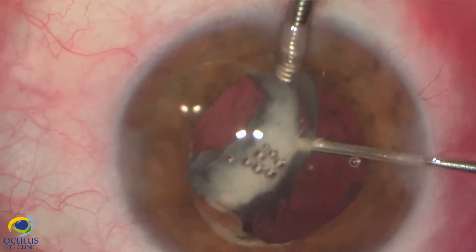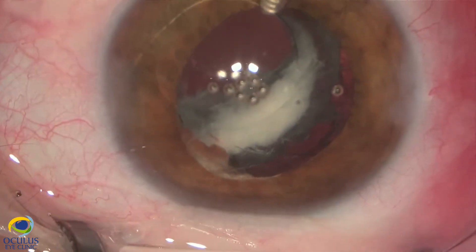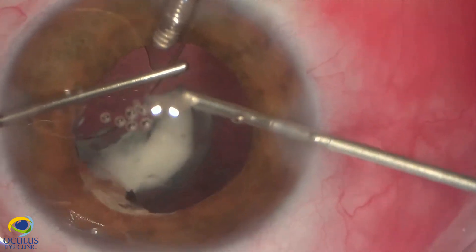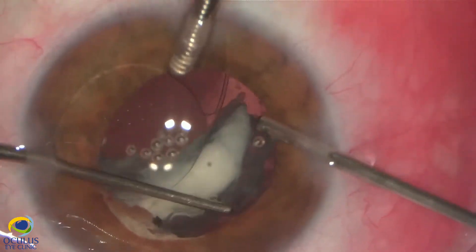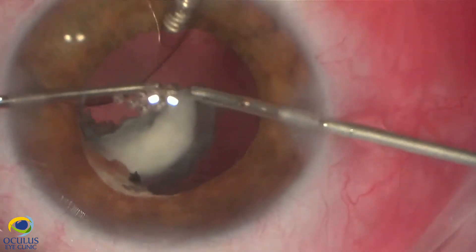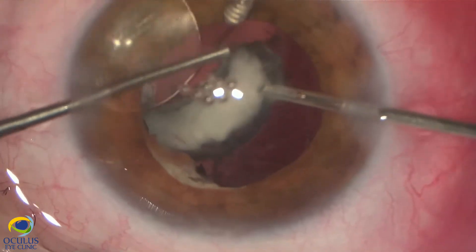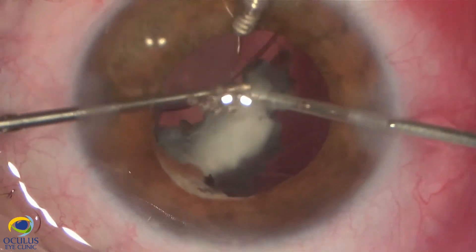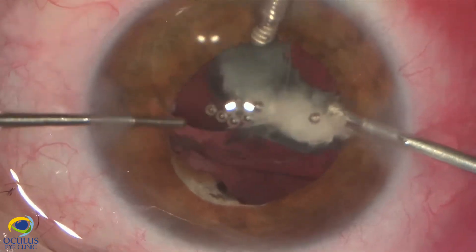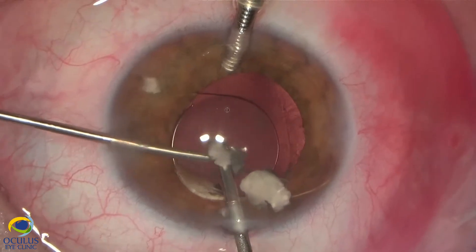It is quite difficult — the cortex remnants are very thick. I managed to bring them by aspiration from the periphery to the centre of the pupil. I am keeping the IOL there for two reasons: first, it was kept as a backup — maybe it will not be needed to be explanted and we can re-implant this one. And second, for protection against the falling of nucleus pieces posteriorly.